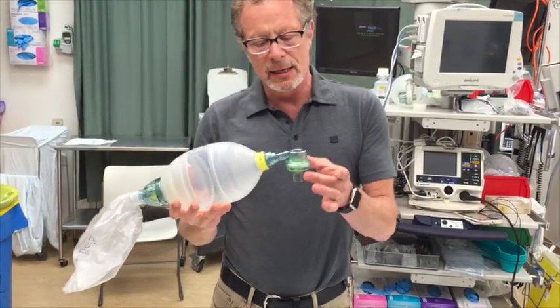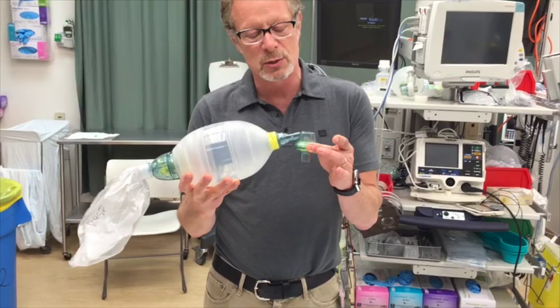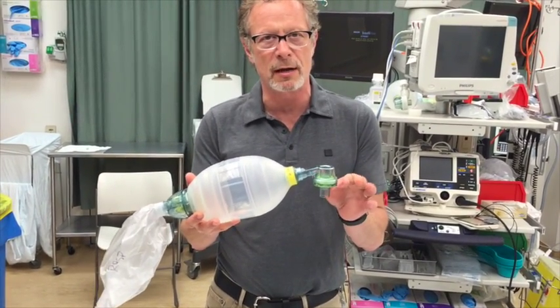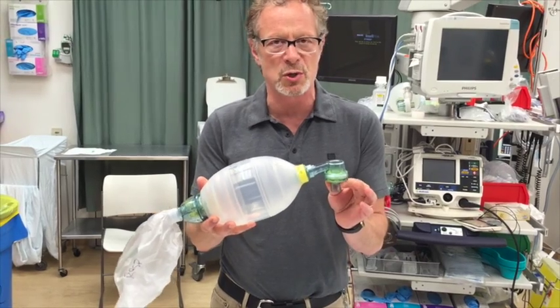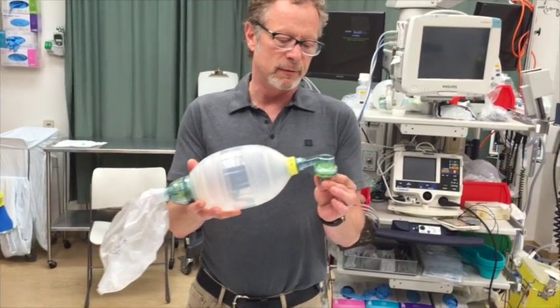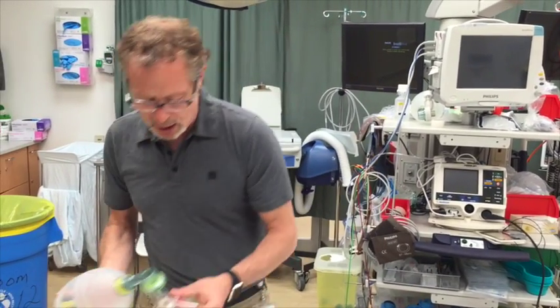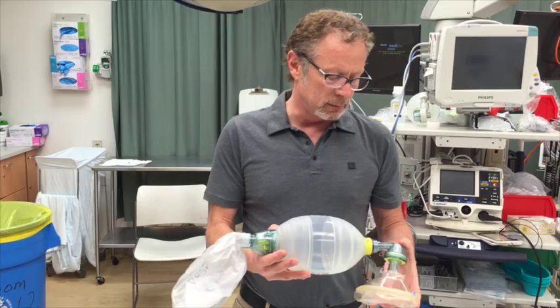In the front, this particular system is what makes it unique and different from others — there are two valves. There's the duck bill valve, and below it there's a secondary expiratory valve. This makes it, if you have a good seal, essentially a closed system.